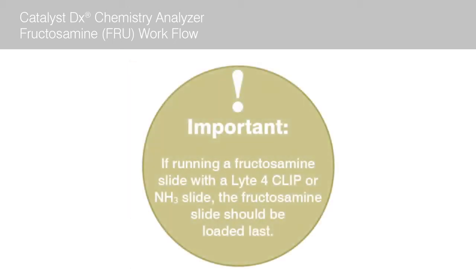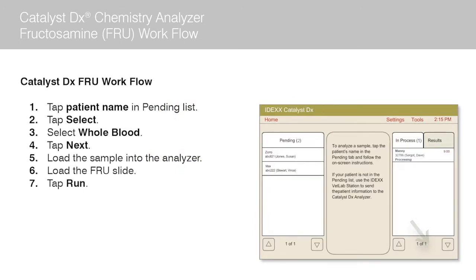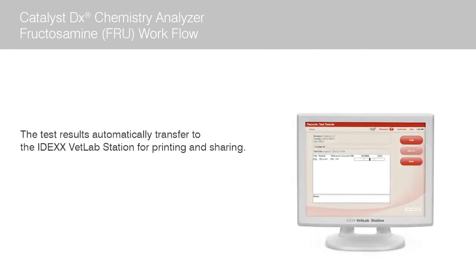Important: if running a fructosamine slide with a LITE4 clip or ammonia slide, the fructosamine slide should be loaded last. Tap run. The Catalyst DX analyzer begins to process the patient sample automatically. A timer displays next to the patient's name in the in-process list, indicating the time remaining until the run is complete. When complete, the test results automatically transfer to the IDEX VetLab station for printing and sharing with clients, and will be electronically incorporated into the patient record.